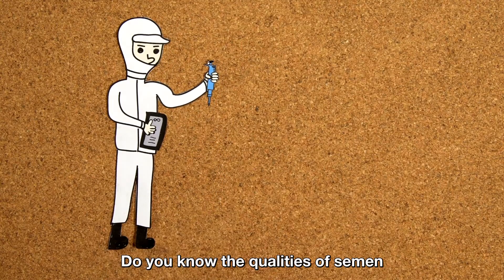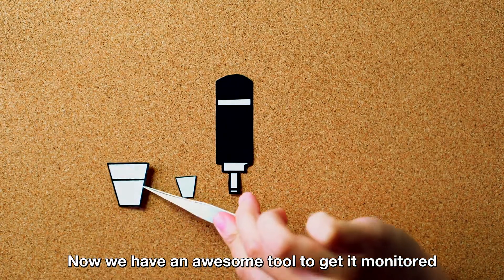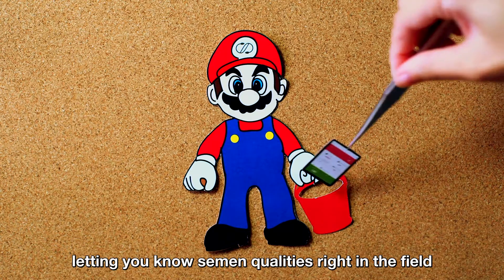Do you know the qualities of semen can affect the effectiveness of breeding? Now we have an awesome tool to get it monitored. Working with smart devices, iSperm is highly portable, letting you know semen quality is right in the field.